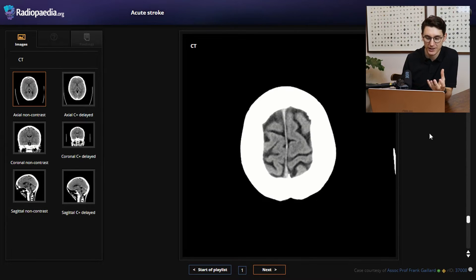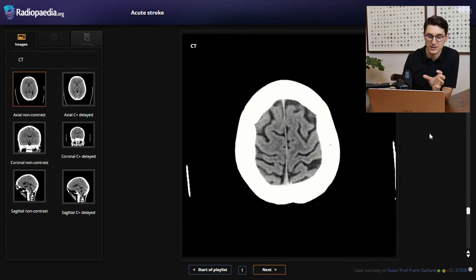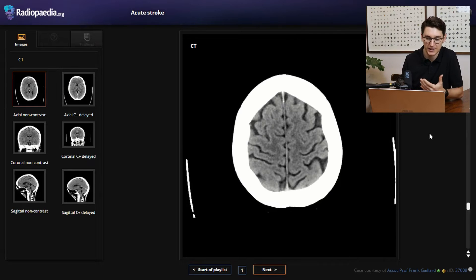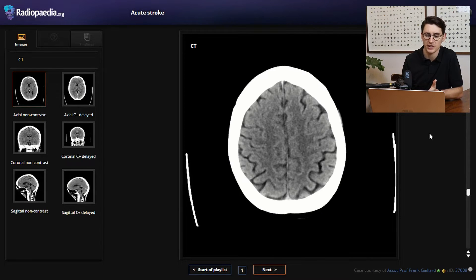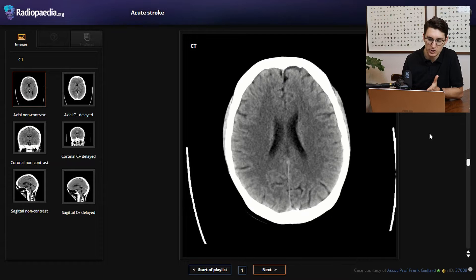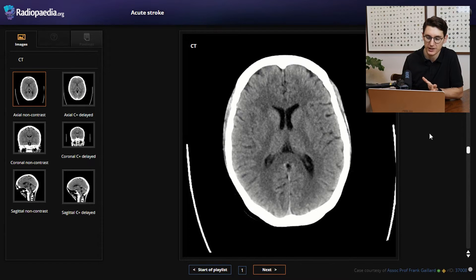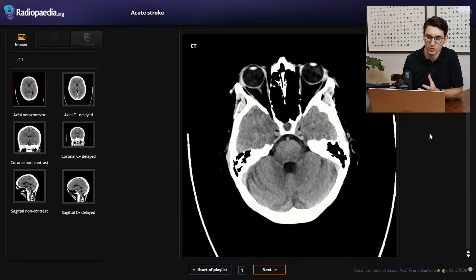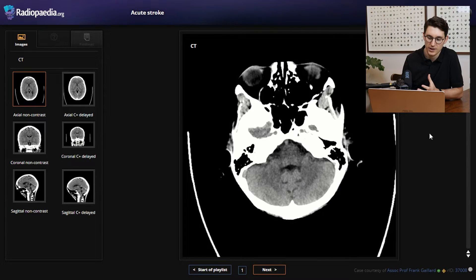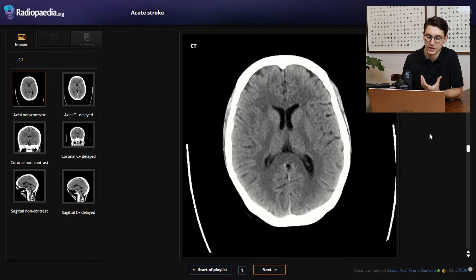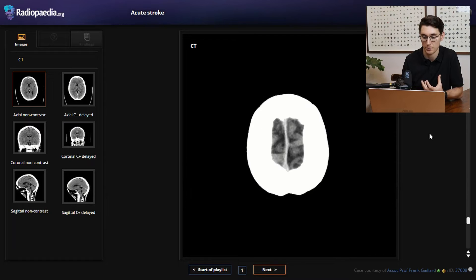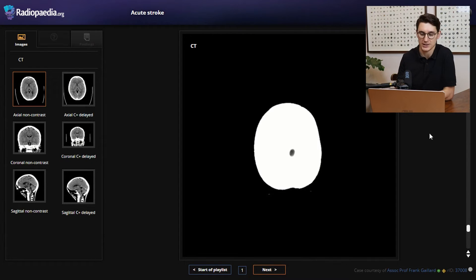You want to look at the sulci and the gyri and see that there's normal space between them. The more scans you look at, you will realize what's normal for different age groups. You can see there's no midline shift here. As we scroll down, we just want to get a general impression of this brain — are there signs of gross edema, can we see the normal structures? We scroll all the way down and back up. Take your time, especially when starting out and learning the anatomy with a CT brain.